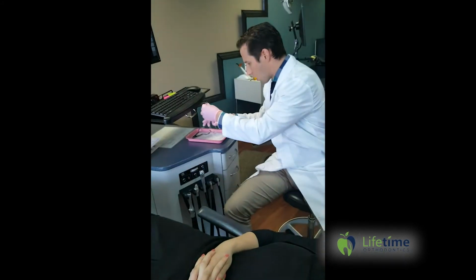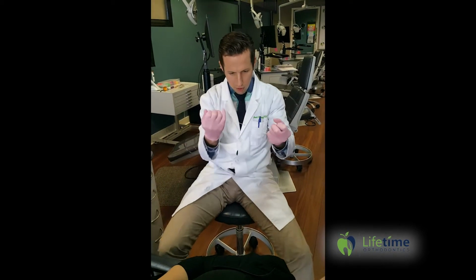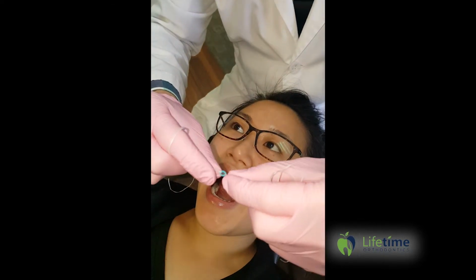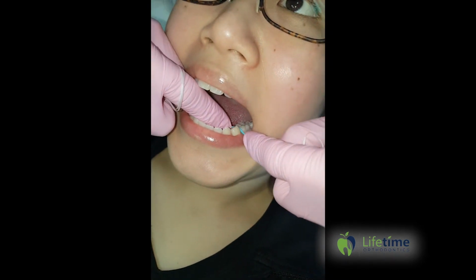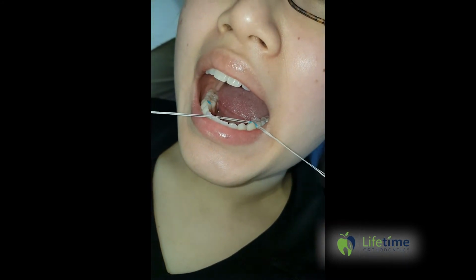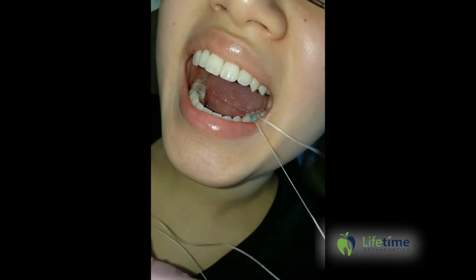Now at home, what you can do is take the separator and 2 pieces of floss, and stretch it out to make it thinner and do the same thing. Now you just want one of the pieces of the O to be underneath the contact and the other to be above. Can you see how that's above? So on this side we're going to floss this in, and then you just pull the floss out. Super easy. Your floss does not necessarily have to be the length of a football field like we have here, but grab a healthy size that you can work with.